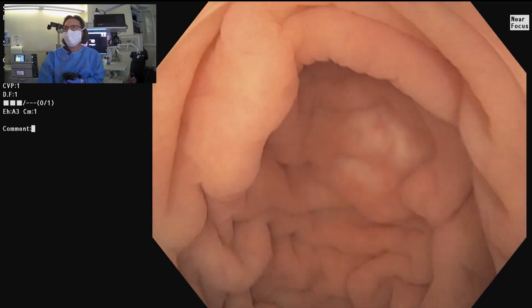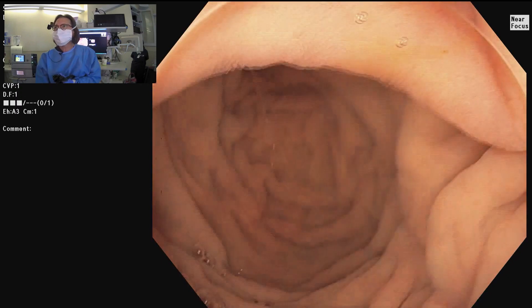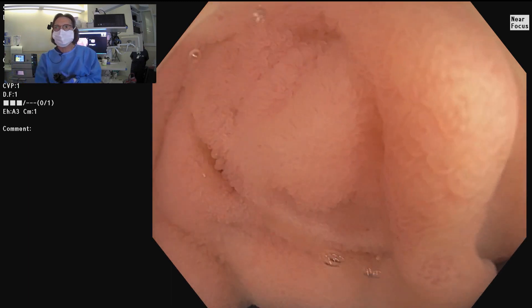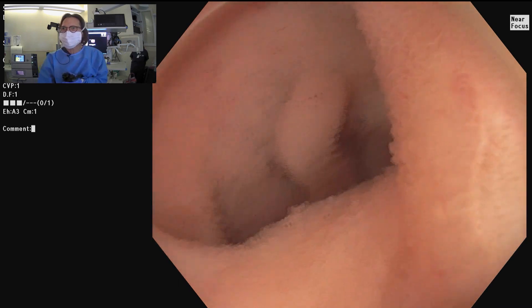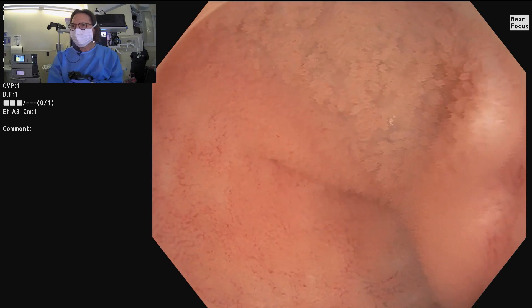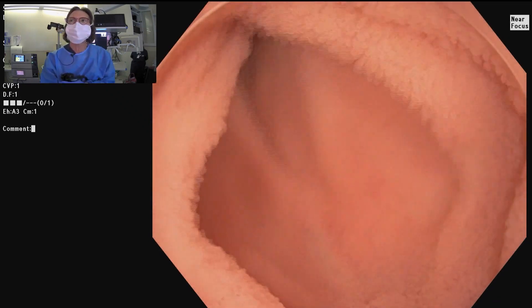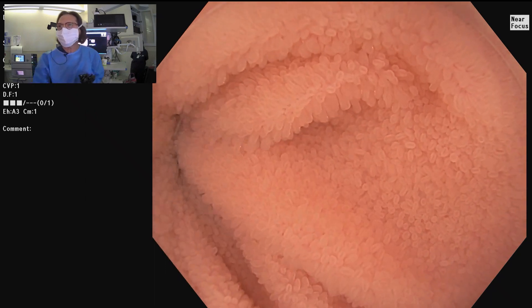I don't think it makes a difference in terms of the electrocautery effect whether you're using saline, although in theory an ionic medium is going to transmit better. Here, the IC valve is facing me — that's what happens underwater. When we give gas, we actually push the IC valve away, sometimes making it more challenging to intubate. So I can just hold the tip of the scope here and very slowly go into the terminal ileum — you can see how beautifully we can see the villi. It's a torquing movement for intubation, and you can go really deep into the ileum using this technique because you don't get looping.